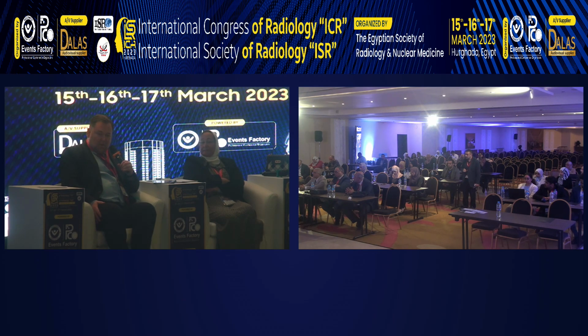MRI of the local prostate bed, because some recurrences, especially after radiation therapy, could be PSMA negative. You definitely need PSMA because the deposits could be somewhere in the bones, and in our experience PSMA is at the moment the best tool to detect even small bone metastases. You can also detect larger masses somewhere in the body, and the nano MRI is a very highly specialized tool to detect small lymphatic or lymph node metastasis deposits in the pelvis. So it depends on the clinical situation.